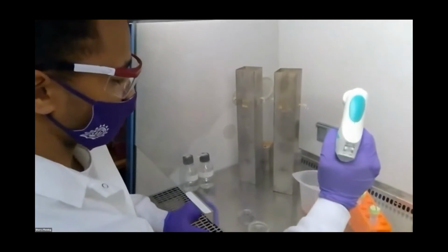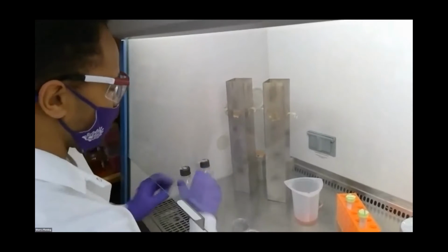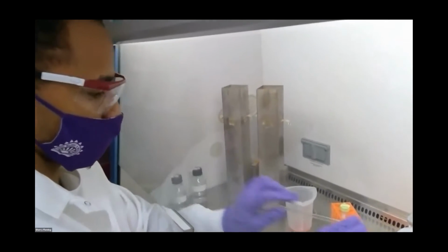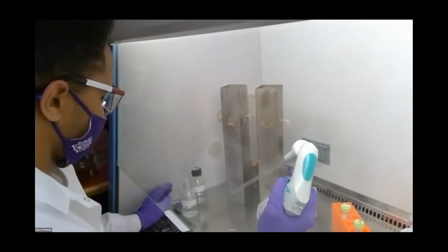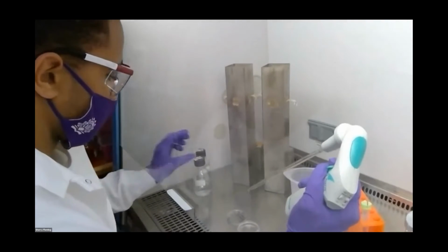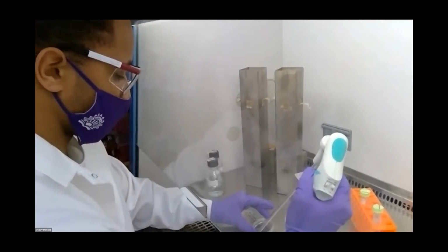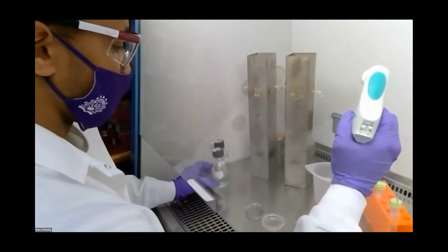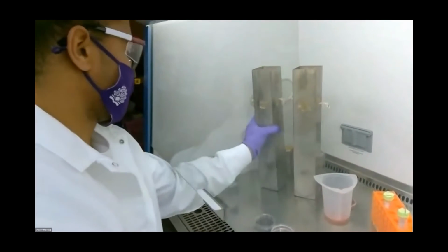All right, so I'm taking off all this old media. Now I will be washing the cells in TC PBS. He's going to wash off the media because it contains inhibitors that allow the next step to not work. These are things that you will learn to do in the lab. I'm going to take off the TC PBS. Now I'm going to wash or kind of break up the cells a little more from the plate using trypsin diluent.